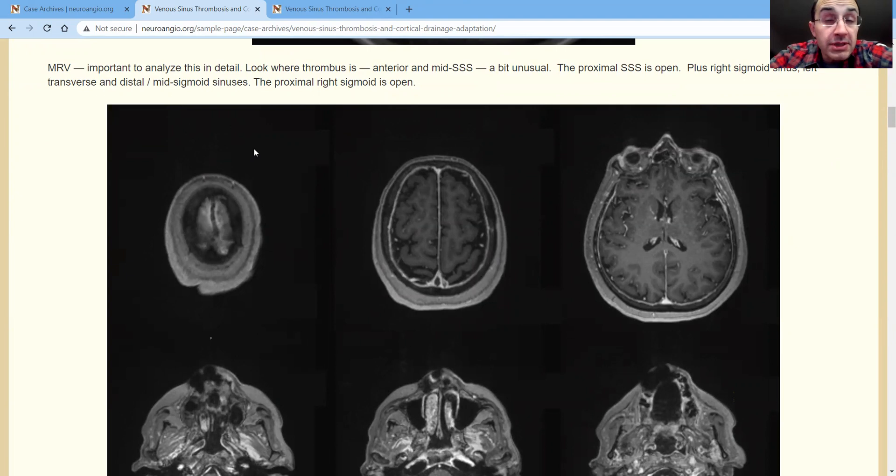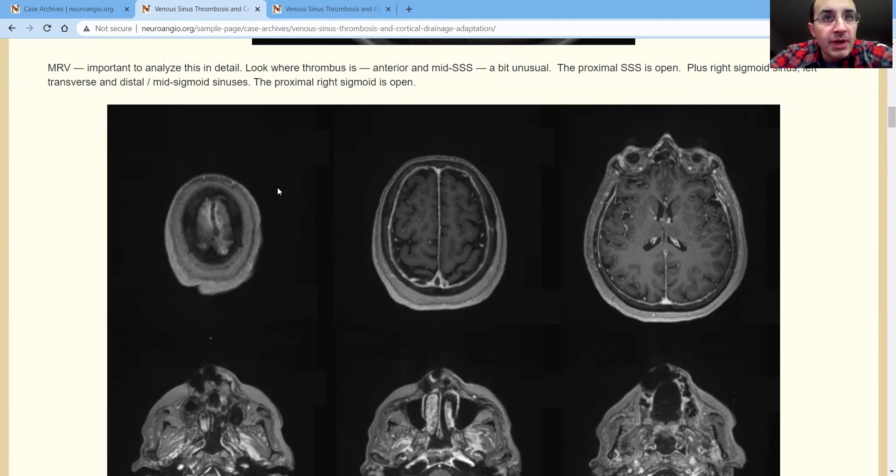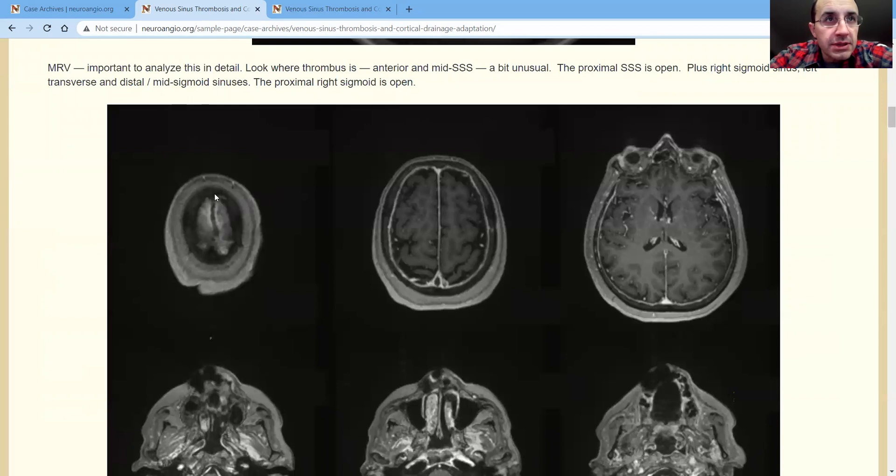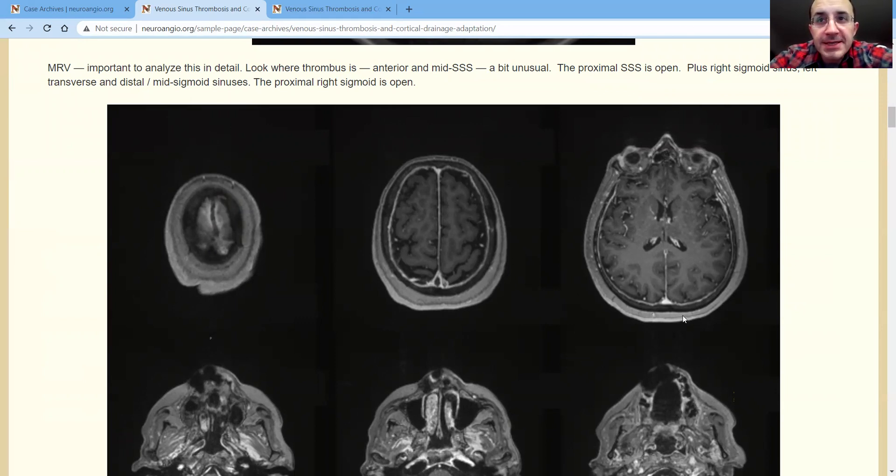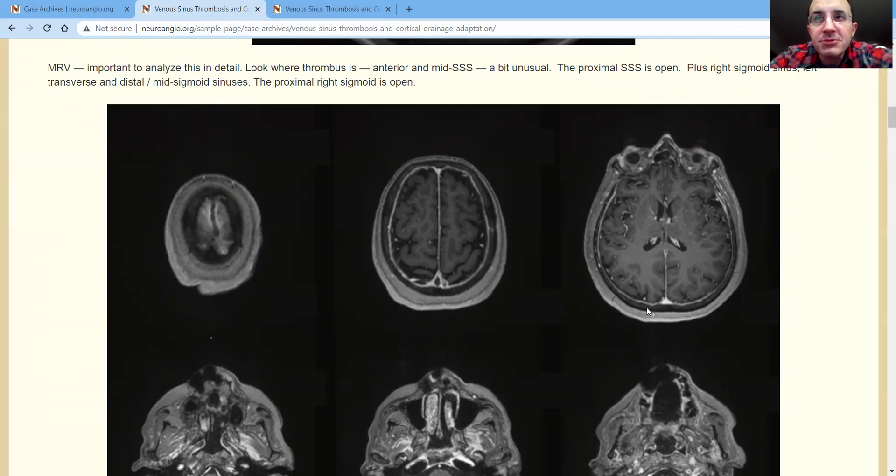Now here we have to pay attention to the details. This is where it becomes important. Where is the clot? So the clot is in the superior sagittal sinus, mid-anterior portion. You can see that here. Now coming down here, we see a skip lesion. There's no clot here, which is interesting and unusual and important.